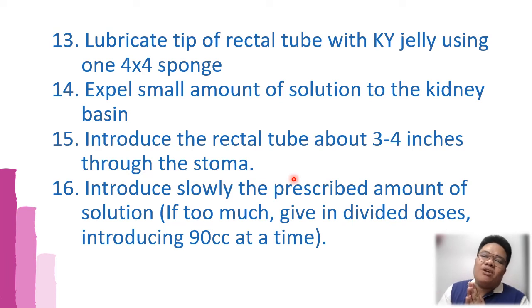Meaning, class, for example, if you would need to introduce more than 200 ml of irrigation solution, if that is ordered by the doctor, introduce it in increments of 90, 90, 90. Then, it's 90, 90, 20 in that case, since 200.